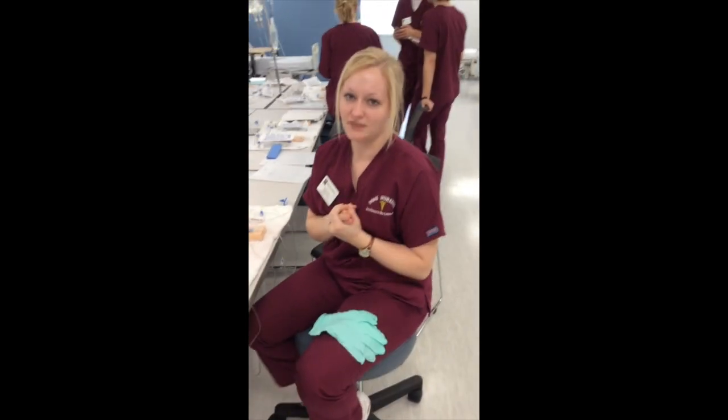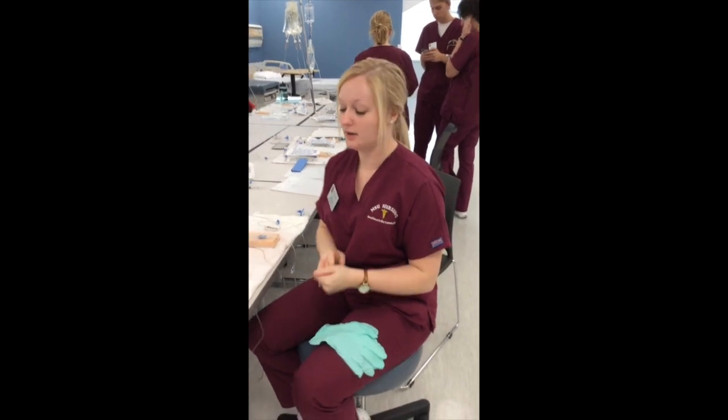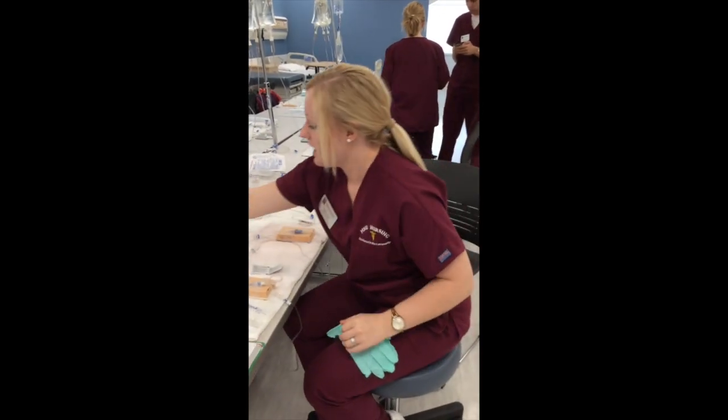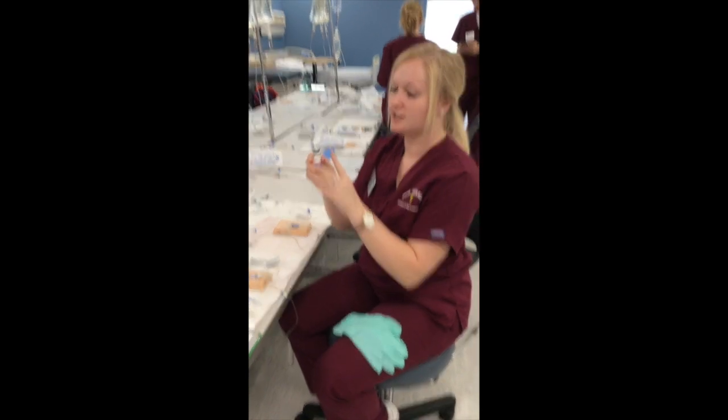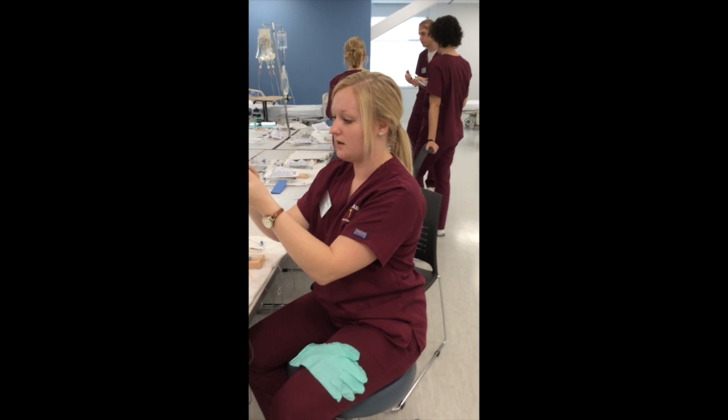So now I'm going to demonstrate giving an IV bolus. The first thing I'm going to do is go to my MAR and get the medication out of the cabinet. Okay, my patient is going to be receiving morphine, so I'm going to make sure, yes, this is morphine, and make sure it's the right concentration.